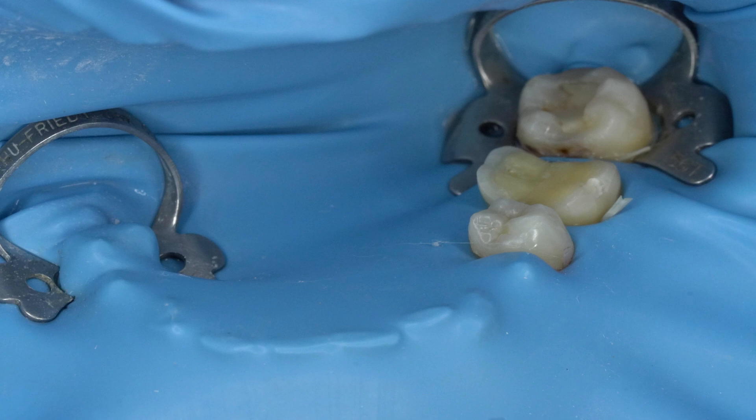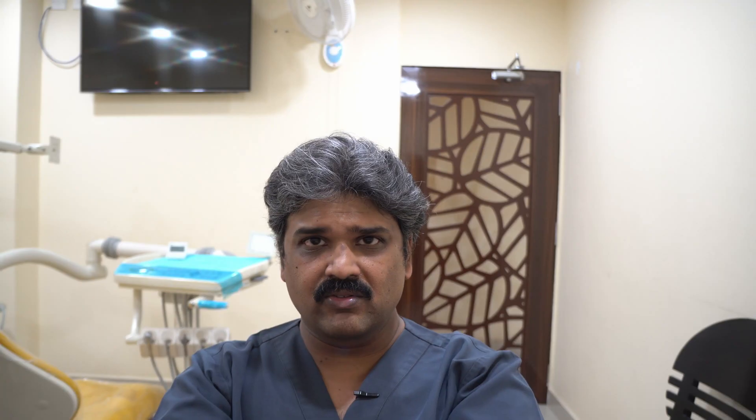They had given me just one box of it. This medium gauge blue silk Sanctuary rubber dam sheet is my new favourite — simply because it behaves like a non-latex rubber dam sheet. It stretches equivalent to a non-latex sheet, it doesn't tear at all. I've literally put it through the wringer as far as restorative work and retractions are concerned, and it has performed spectacularly. I have not seen this rubber dam sheet tear even once. It is one of the easiest sheets to invert around the tooth.